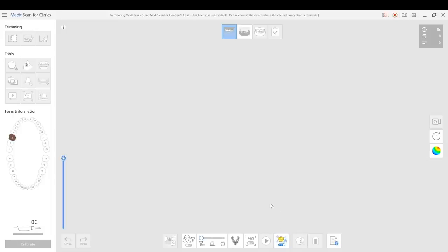So when you turn this filter on, there's some advanced technology that helps you image metal much more readily and easily. Personally, I just prefer to change my angle, have the light hit that surface and bounce in a different direction, and then from there the camera can pick up the surface topography of what you're trying to scan.